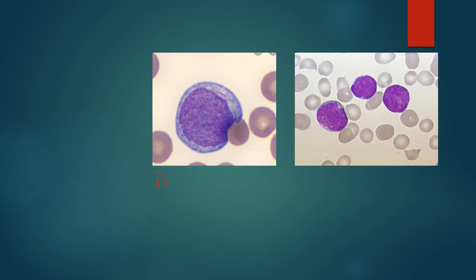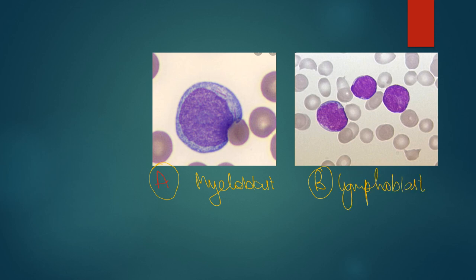Cell labeled as A is a myeloblast and cell labeled as B is a lymphoblast. M for more in size — this is a larger size cell compared to a lymphoblast. More amount of cytoplasm — you can see this has more cytoplasm compared to the very thin rim of agranular cytoplasm in a lymphoblast. Myeloblast is characterized by 3 to 5 prominent nucleoli, whereas lymphoblast has inconspicuous or hardly 1 to 2 nucleoli. The presence of Auer rods is a very important feature — you can see these rod-like structures. If Auer rods are present, you can easily make a diagnosis of myeloblast, and they will be completely absent in a lymphoblast.